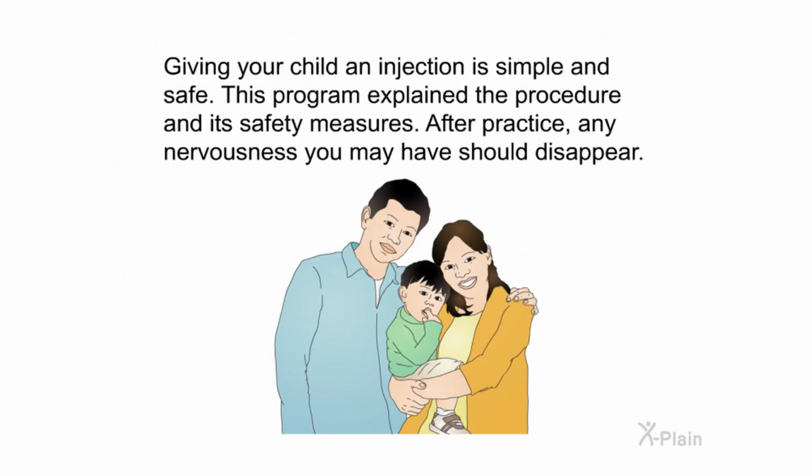Giving your child an injection is simple and safe. This program explained the procedure and its safety measures. After practice, any nervousness you may have should disappear.